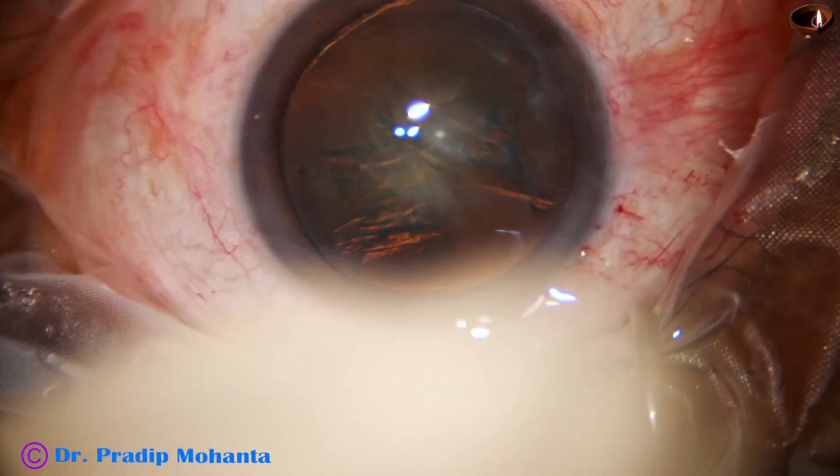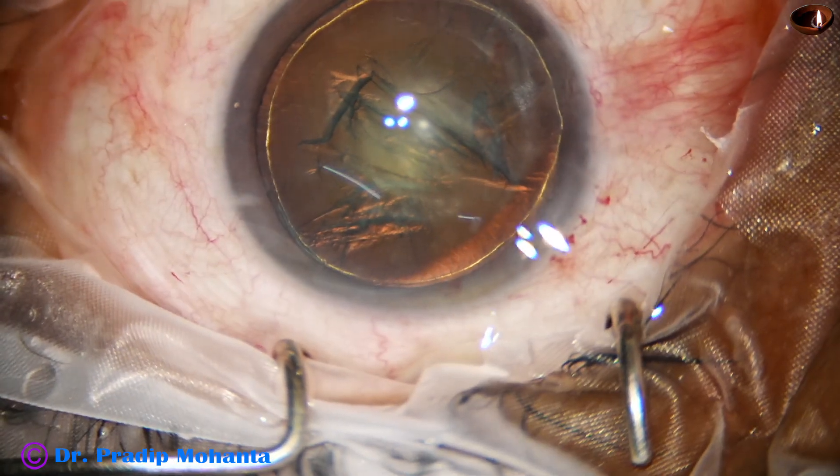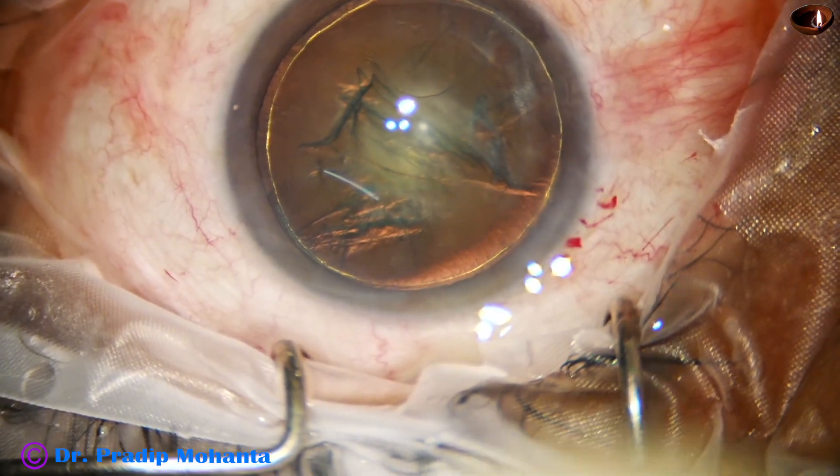Hydrodissection is done, and hydro delineation is also done. We can see a golden ring in this case.